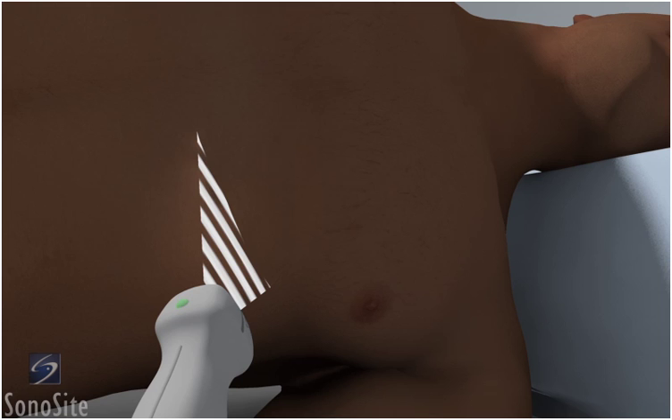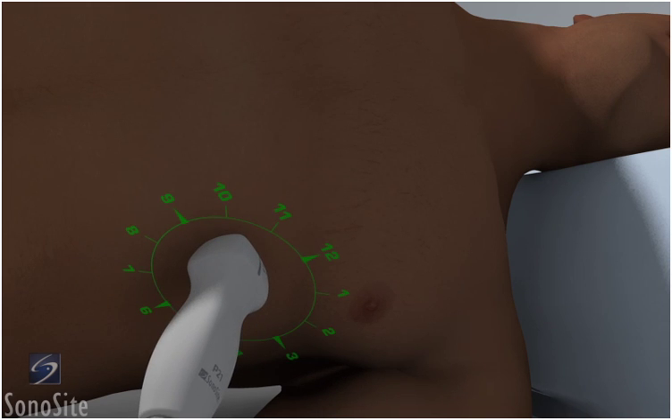Place the transducer at the apex or point of maximum impulse with the orientation marker to the patient's left side at a 3 o'clock position.